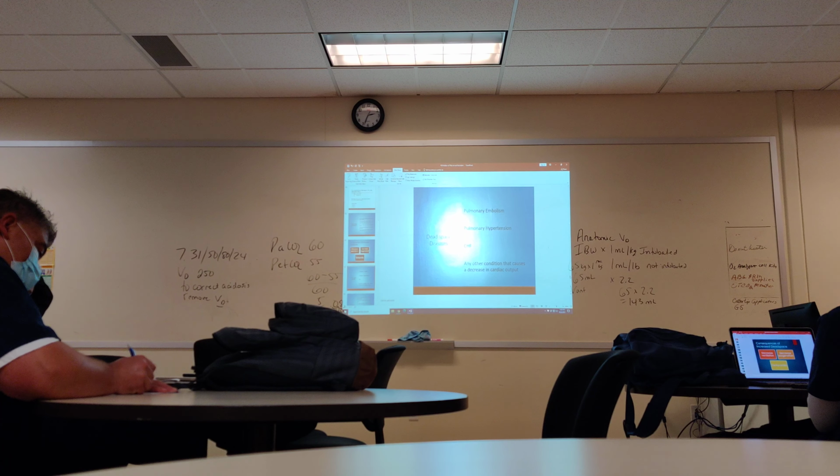So we consider a mismatch when we've gone up on that FiO2 to 60, which is that convenient rule too for the boards. If I've given you FiO2 of 60, you have not improved. That is when I've officially made a shunt happen. A shunt is happening, I have found it. I need to treat it now with some pressure. Doesn't matter that little fat alveoli I drew. Doesn't matter if I dump him full of 100%, it's not getting there. Okay, it's not gonna get there.